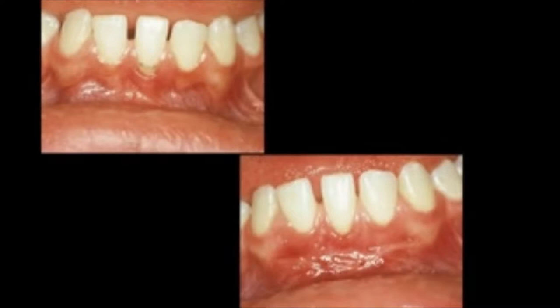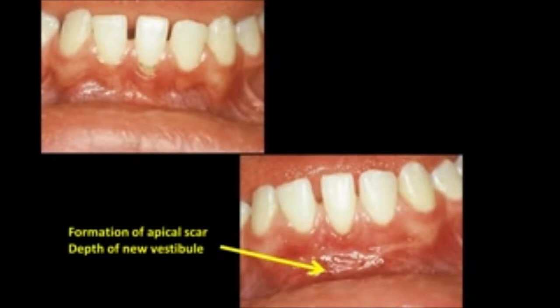Here we see on the lower right how the scar is beginning to form — this is about a 2 or 3-week post-op. This is the procedure that we are going to do in the maxillary arch to deepen the vestibule and get a better fitting maxillary denture.